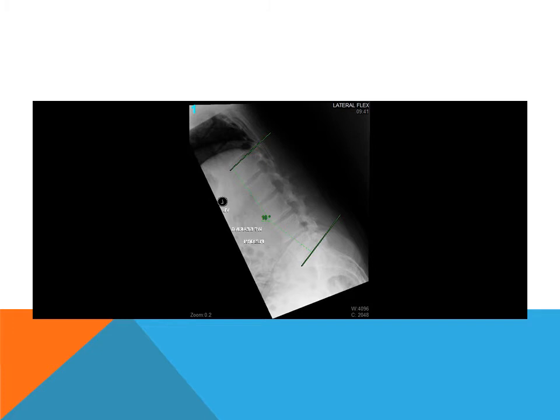So we've lost 50 degrees of lumbar lordosis in moving from neutral lateral to full flexion. That loss of 50 degrees is distributed among each of the individual motion segments. So when we measure each of the intersegmental angles and compare the changes from the neutral lateral, those changes should all equal 50 degrees of change.